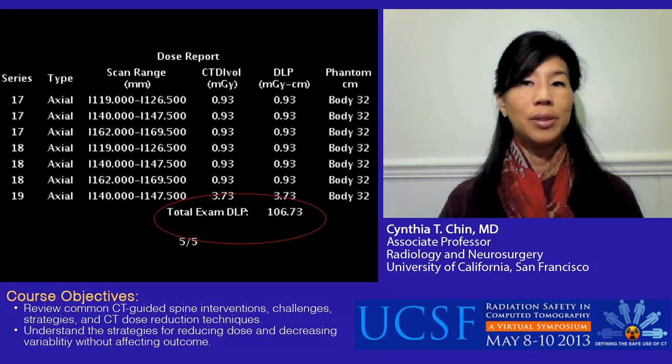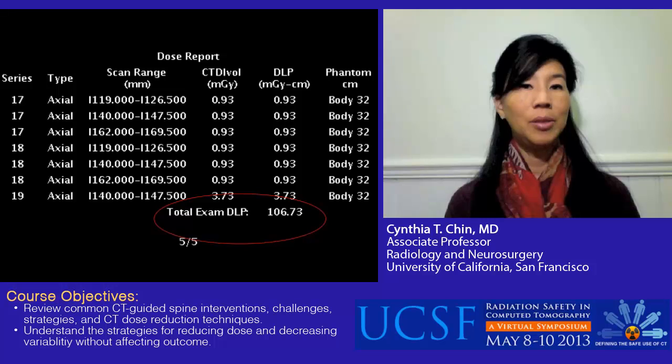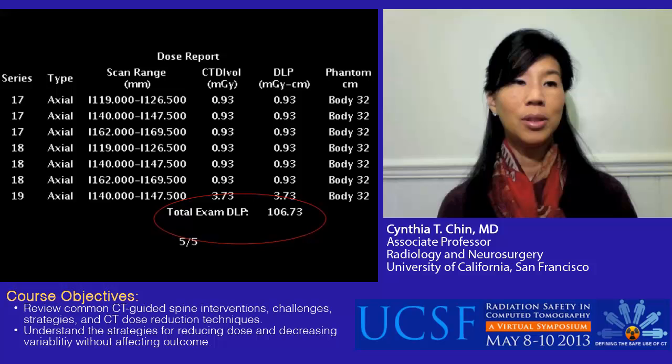And you can see that the exposure is quite minimal, with the DLP measuring only 106.73 for this particular multi-level, multi-needle, multi-injection procedure.